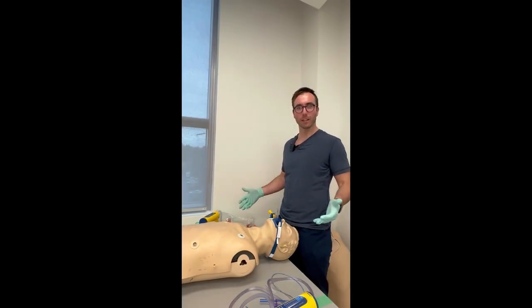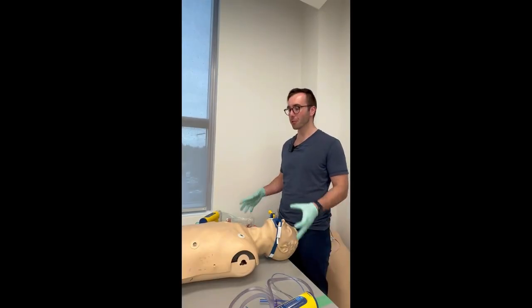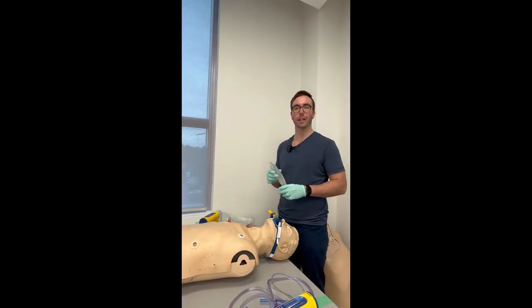Hello everyone, it's Ryan. Let's go over gastric port suctioning — we're going to do the physical skill of it. We'll review the i-gel and King LT airway devices, as some services in our catchment area have King LTs. The i-gel is a very good supraglottic airway device, and now we can suction the gastric port.